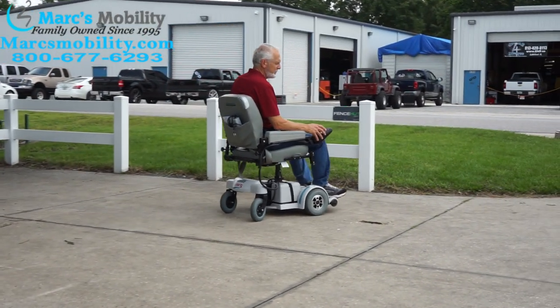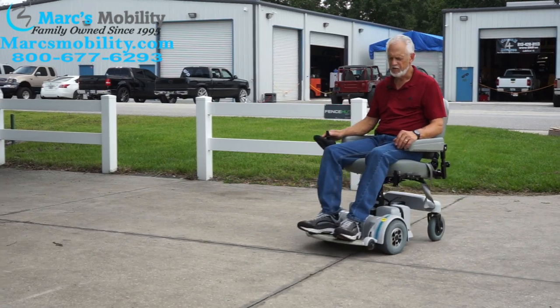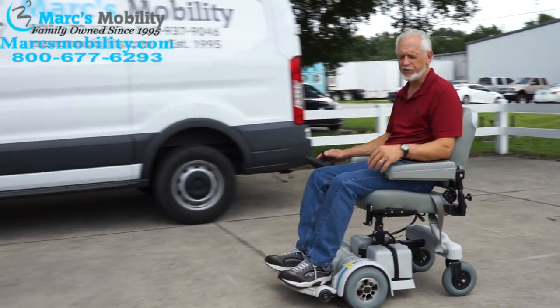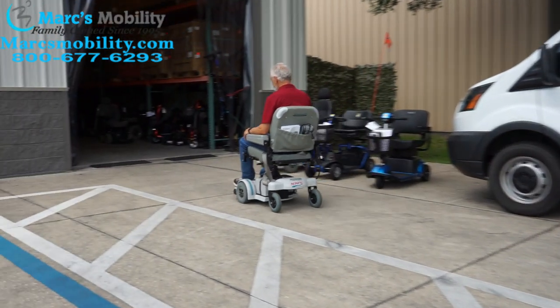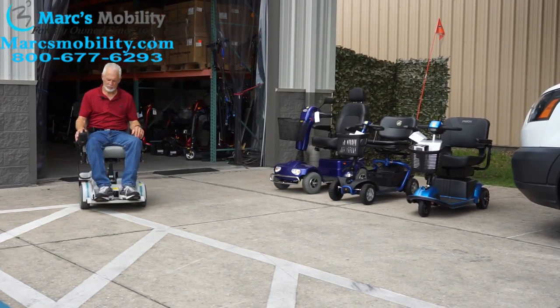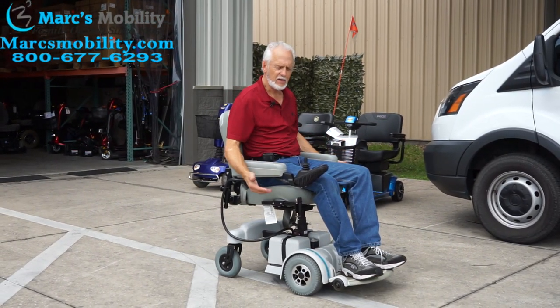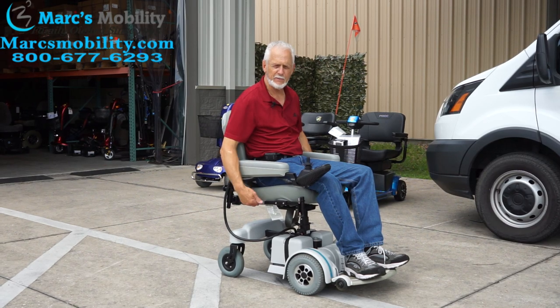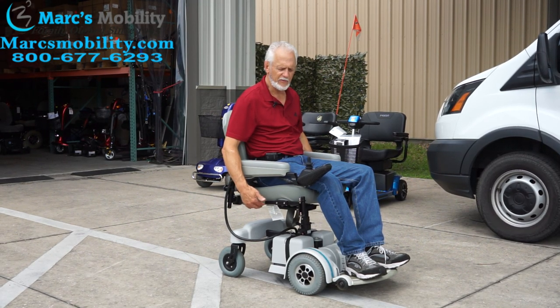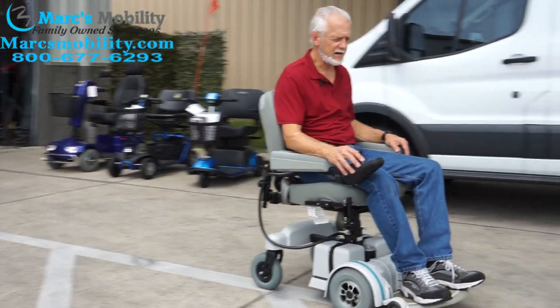This is the Hoveraround MPV-5 — this one has 49 miles, used 2 or 3 months by a bad driver, runs like brand new. When you stop, the chair comes to a halt within a couple of feet because it has electromagnetic brakes. It does have a seat lift — I'll show you that in a minute, but let's take it for a ride.